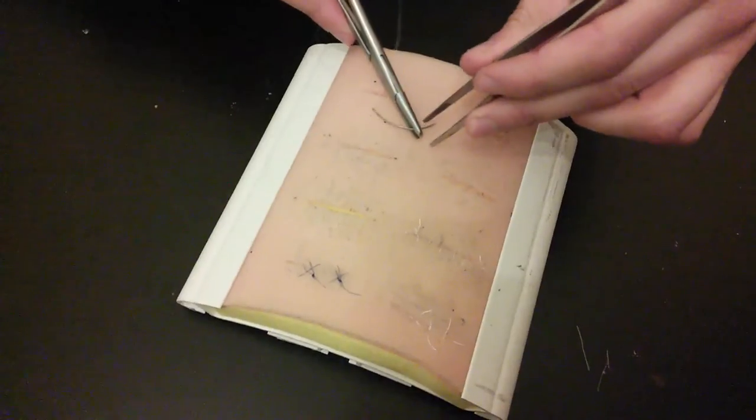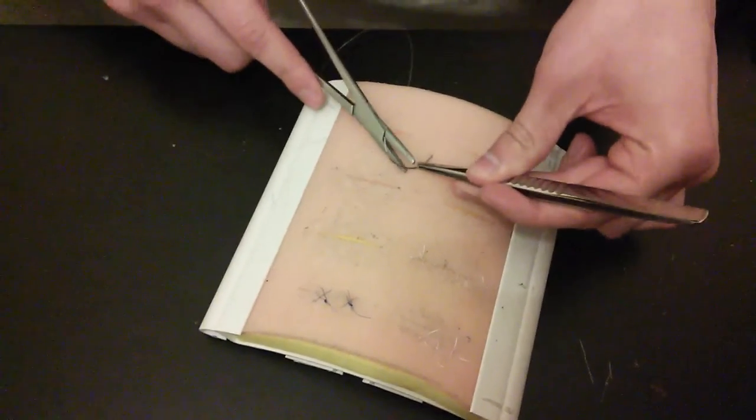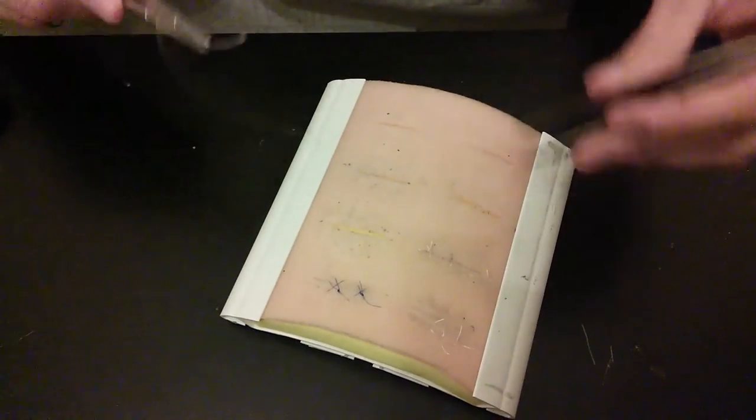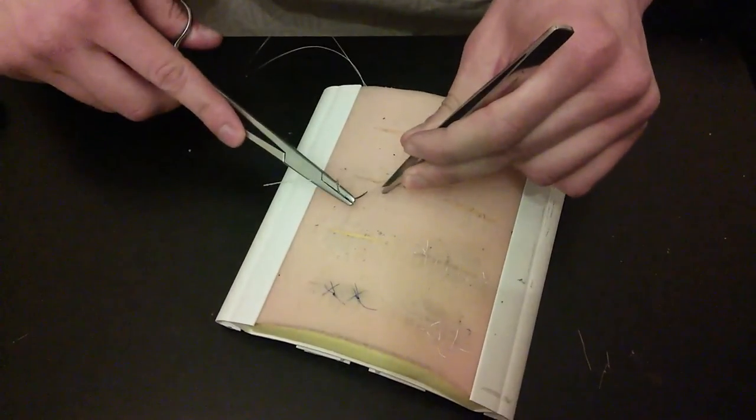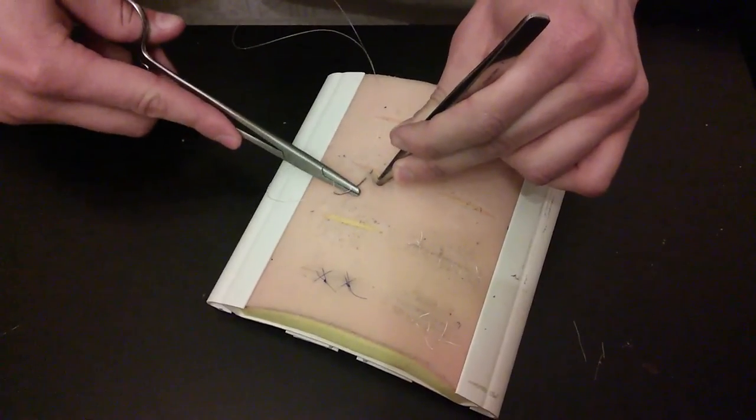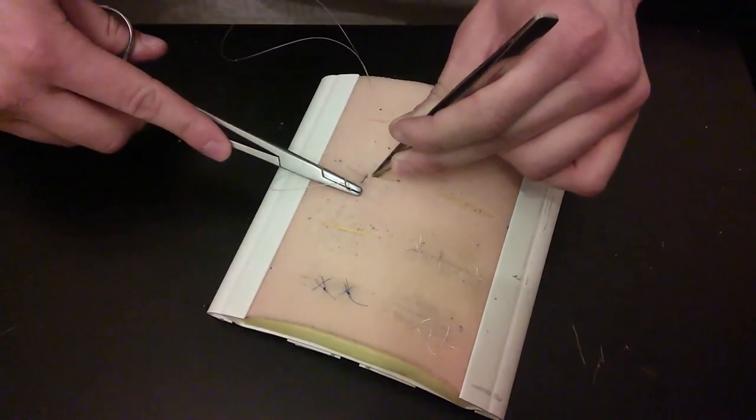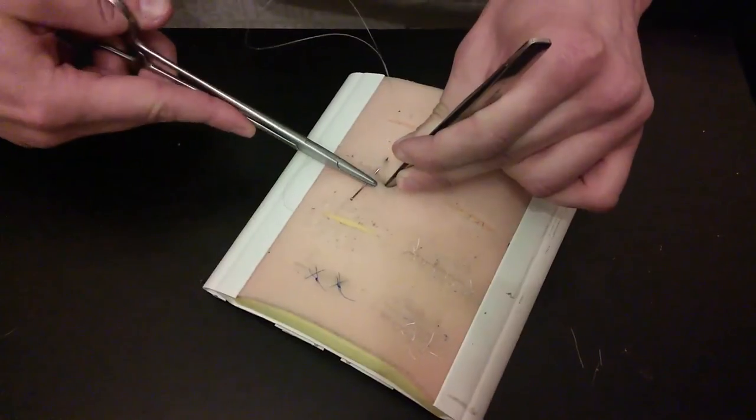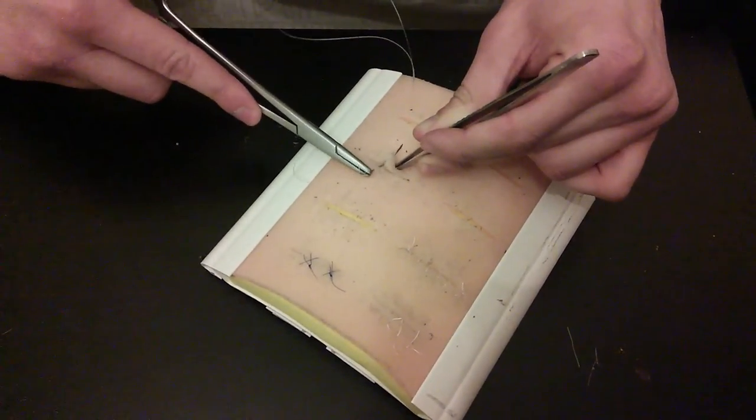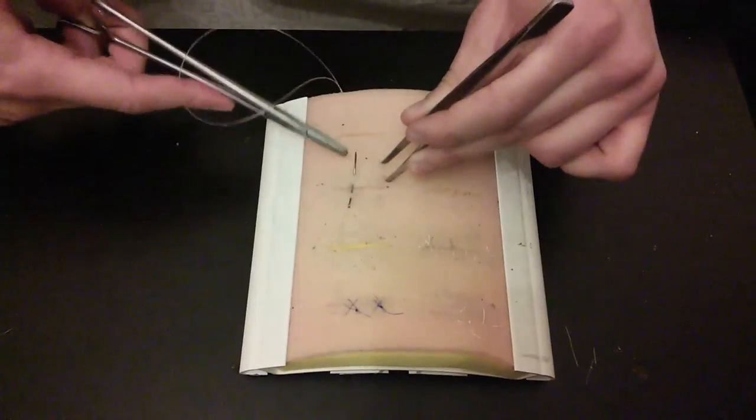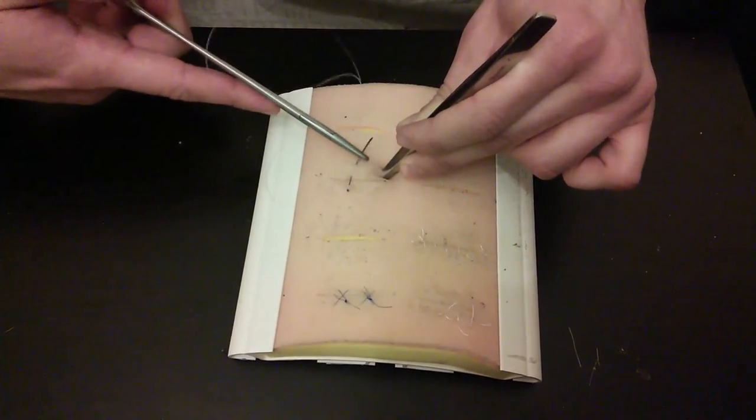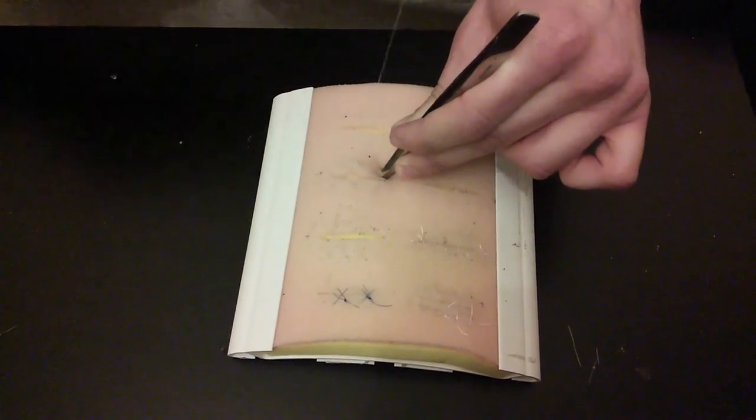We are going to adjust the needle. Remember never touch the sharp end. Cross over, go about 5-8mm down, go through again, and come through.